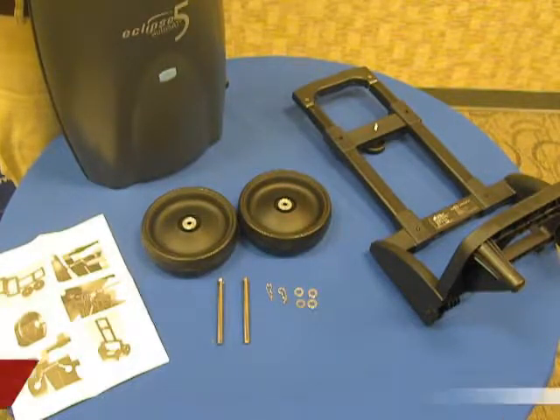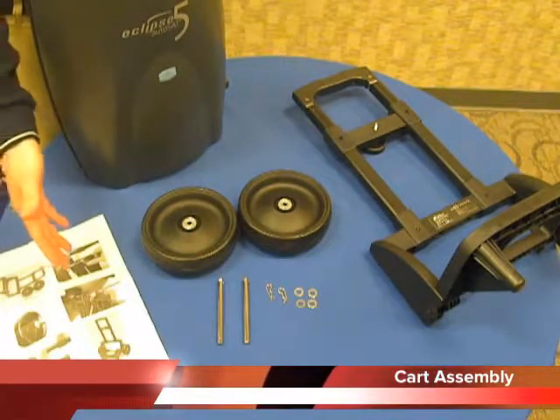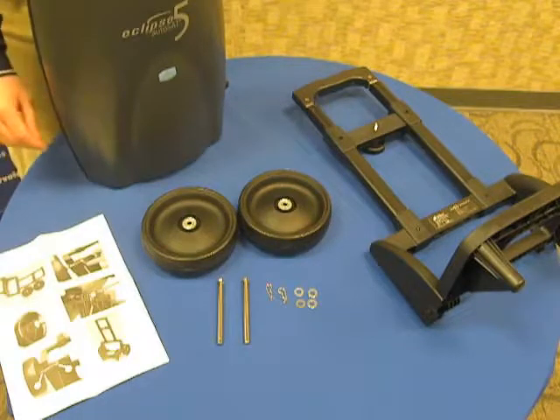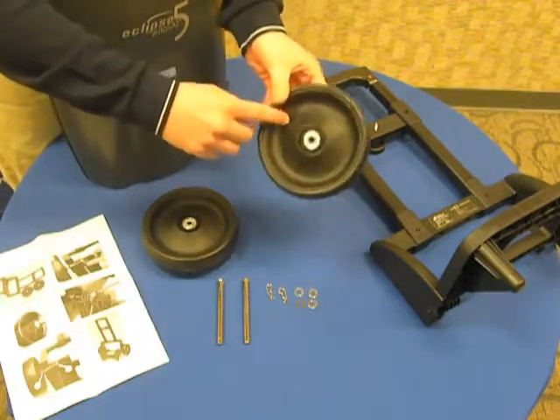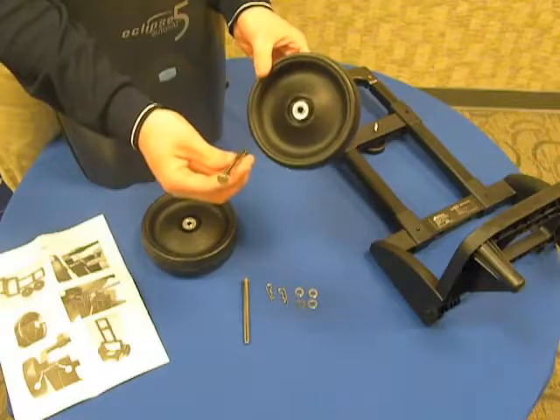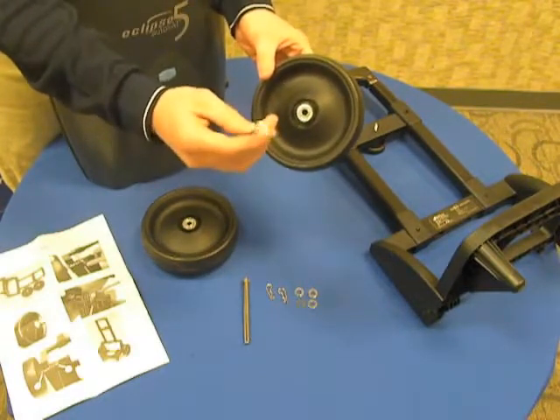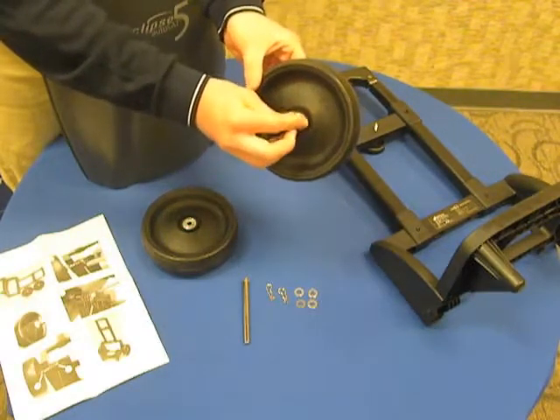All right, now we'll go ahead and assemble your cart. Do reference your instruction sheet that came with the Eclipse 5 on how to properly assemble the wheels to the cart, but it is a pretty easy process. Again, remember that the smooth side of each wheel is going to go to the outside of the cart. So we'll start by taking your axle rod and inserting it into the wheel. There is a built-in washer on one side, and this will go to the outside as well. So make sure that that end faces the outside.